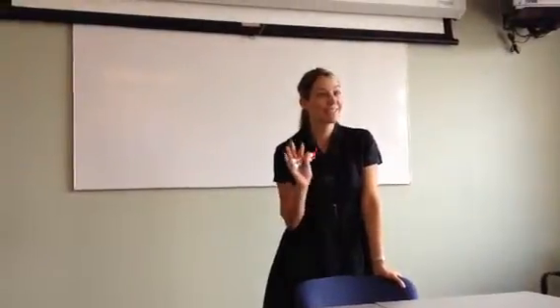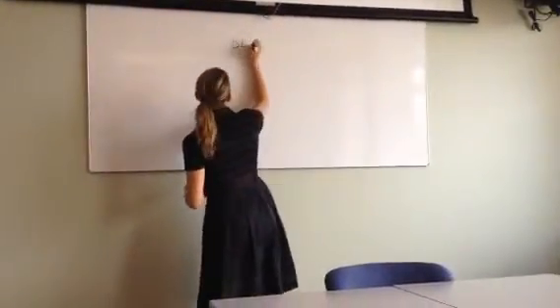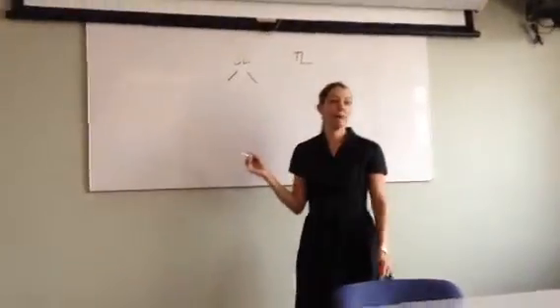All right, so the very first thing I want to do is review the basic Straumann implants and sizes, if you remember. Straumann sells two basic types of implants. What are they? Bone level, tissue level. Under bone level, there are two what I would call restorative platforms. What are they?